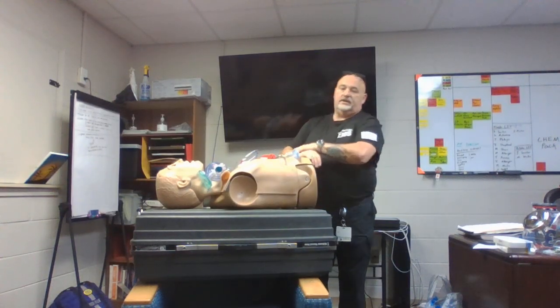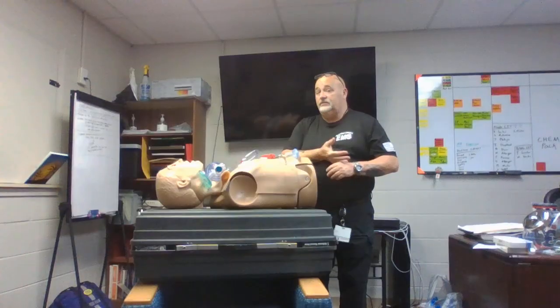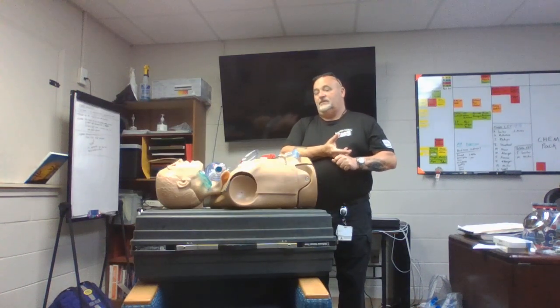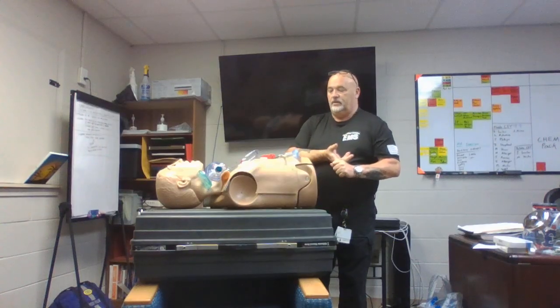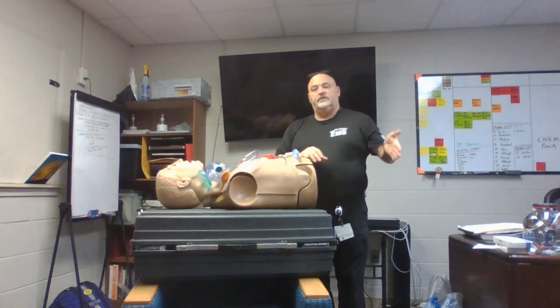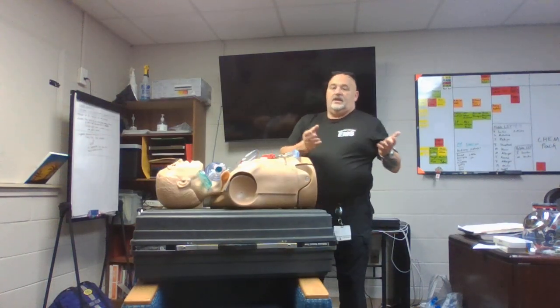So the important thing is that we know the sizes, when to use them, how to use them properly, and once they're in place, what signs do we need to look for? What could be our issues coming up? There are indications for everything. There are contraindications for everything. Correct? You have a patient who needs BLS management.